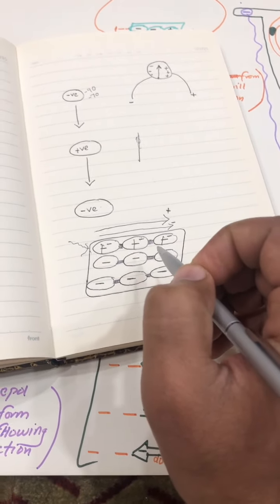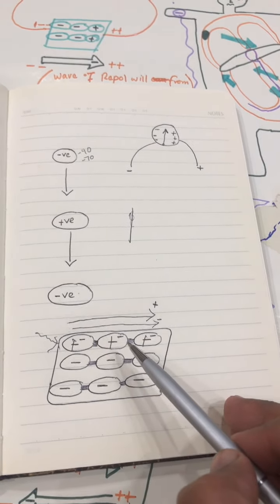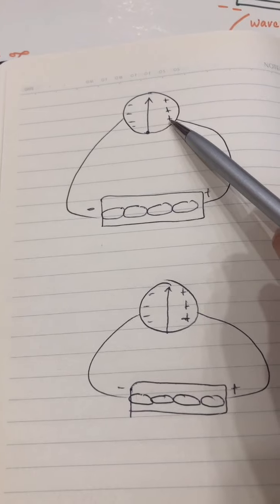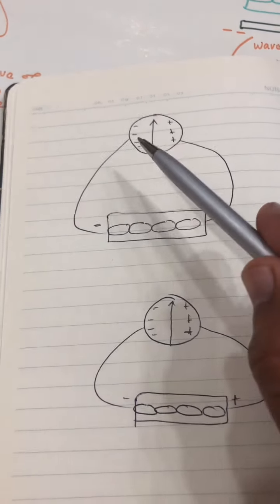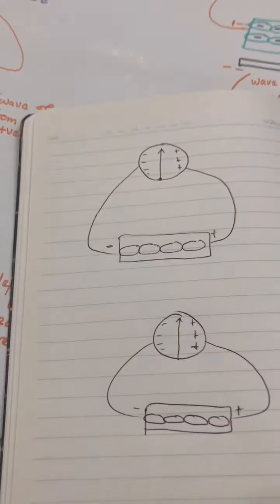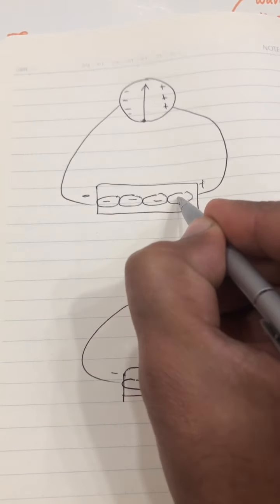Okay, now let's connect this galvanometer with this tissue, which consists of lots of cells. It's drawn on this page. Okay, so this is the galvanometer, and it is connected to this tissue with the help of a positive electrode, which is coming from this galvanometer, and a negative electrode, which is coming from this galvanometer. Okay, and see, this should be normally negative, right?